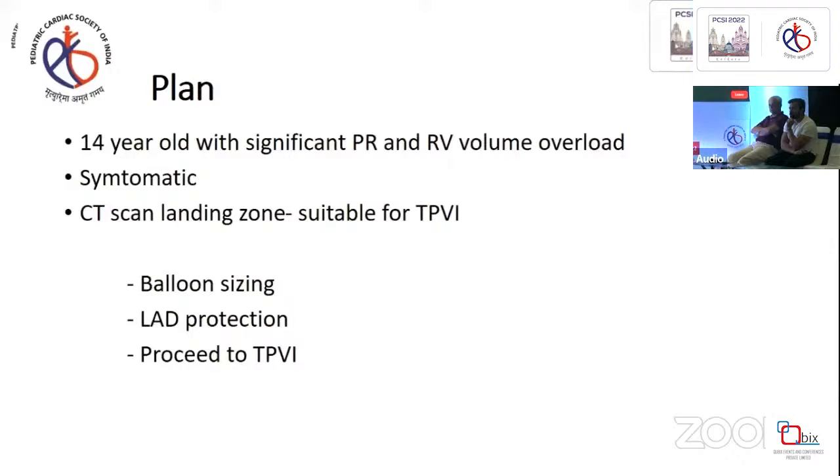That's my point. So the acute results have been good so far with our experience, but we need to have long-term follow-up of these patients, because we don't know how these stents behave over the long term, whether there are any fractures or that. We need to know. But acute results have been very good consistently.